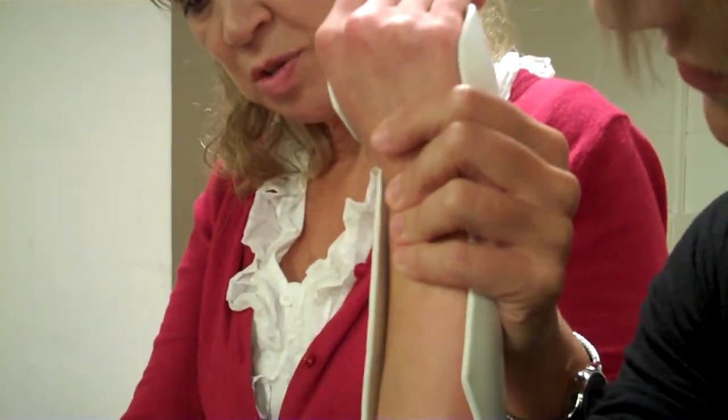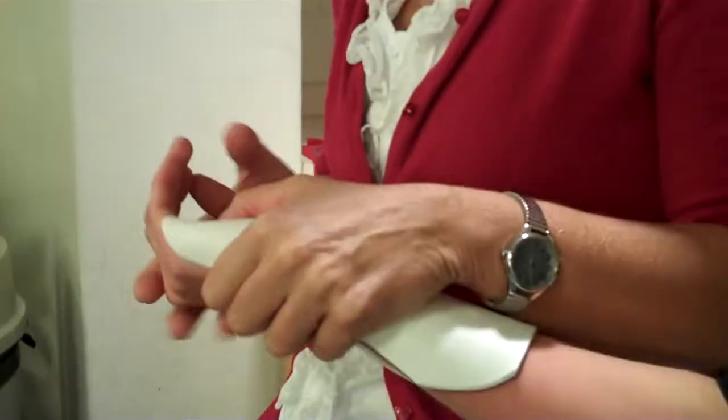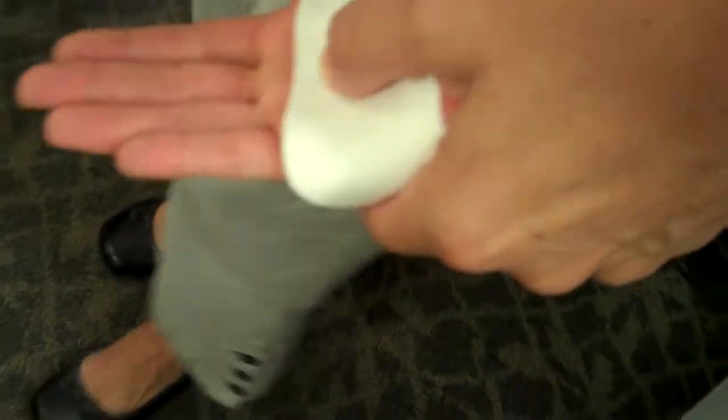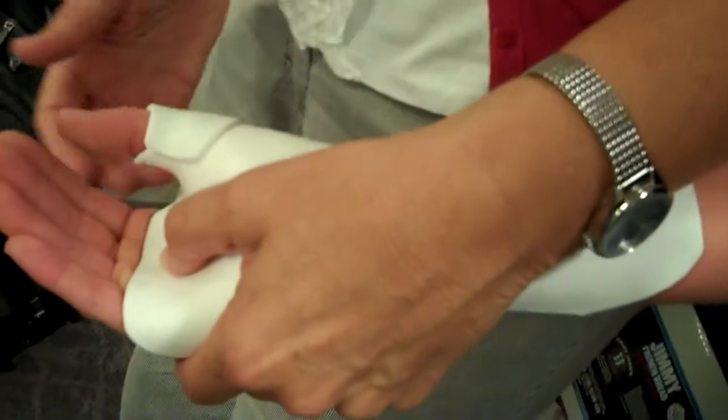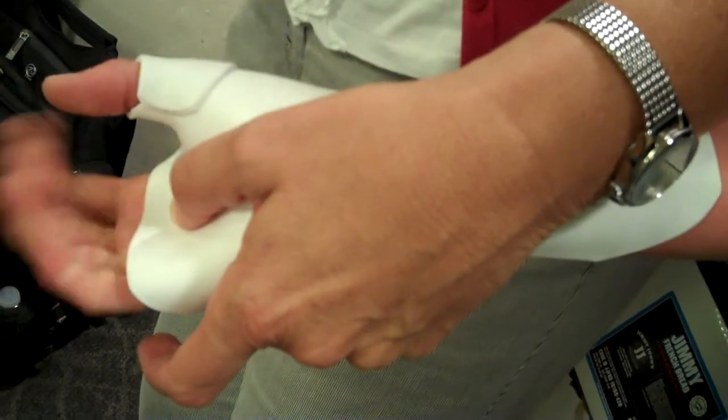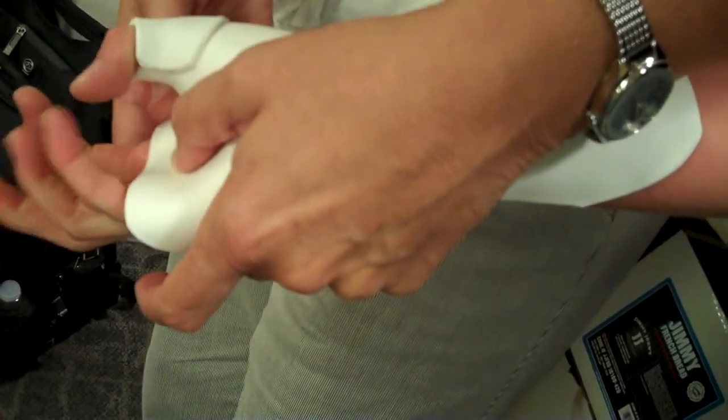We know that we've got it too long there. That's going to be pretty easy to fix. And again, look at her. We've covered her up. And this is what I'm talking about, it being too high on the ulnar side. So she can flex her fingers, but it's not ideal. You haven't cleared that crease. It's really impacting the fifth digit. Okay. So let's go ahead and look at it.